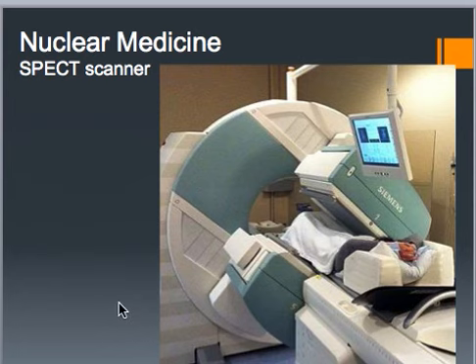Nuclear medicine scans are very low resolution images. They're not meant to have a high resolution. They're not meant to be super clear. They're meant to show the hot and cold spots. So even to get those images, because it's a lower dose of radiation that the patient's emitting, these cameras get kind of close to the patient. So some patients who are claustrophobic, that can be a problem.